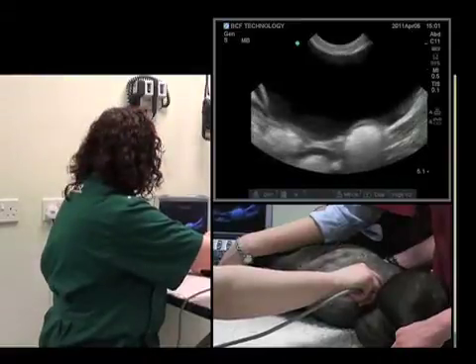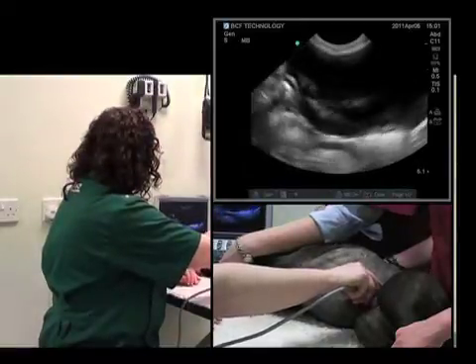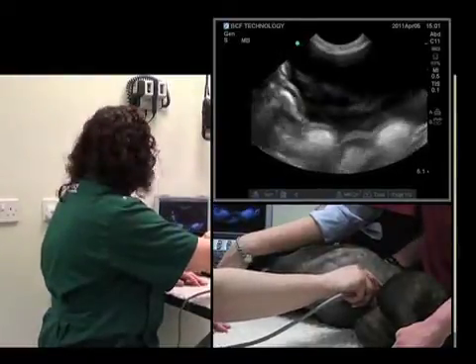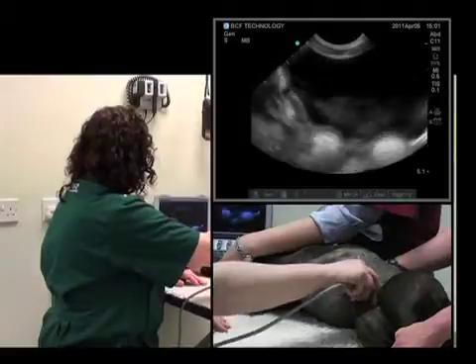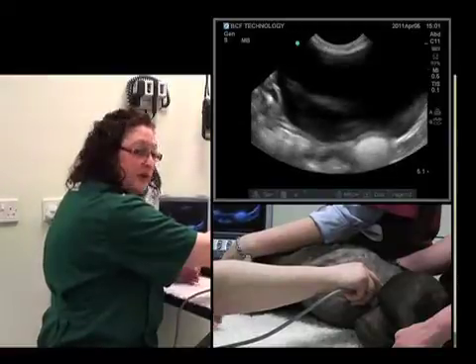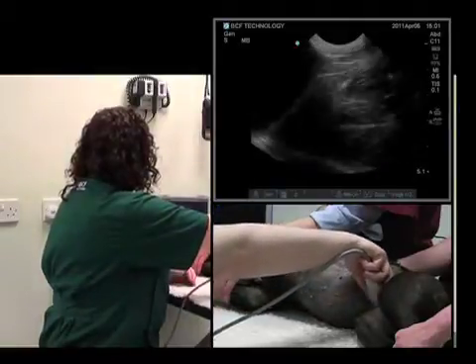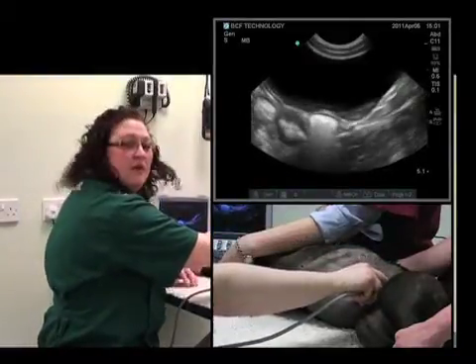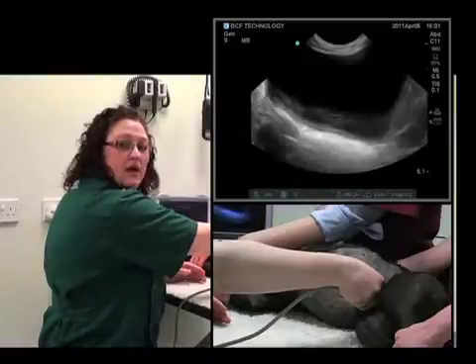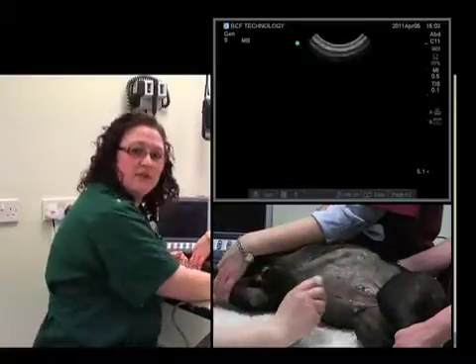That's better. We'll start at the cranial margin of the urinary bladder and we can fan up and down in order to evaluate it. We can then move caudally and repeat. We can then rotate through 90 degrees clockwise, slide cranially, and we've seen the entirety of the urinary bladder.